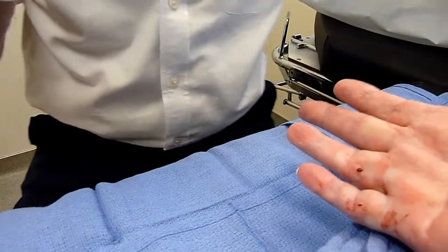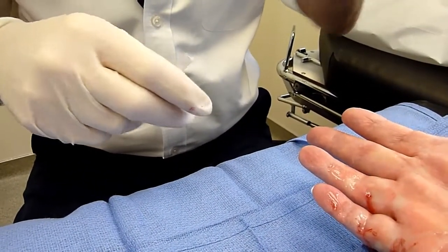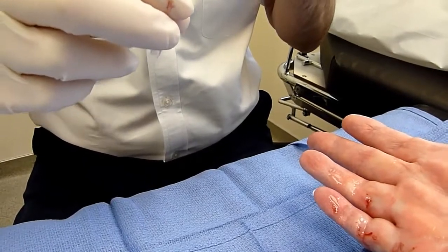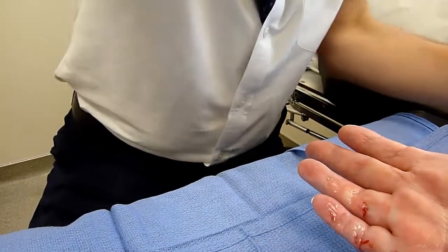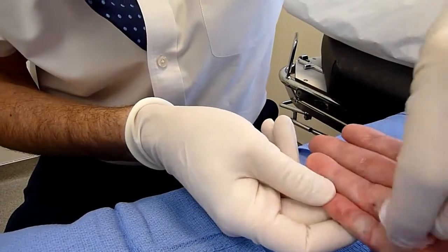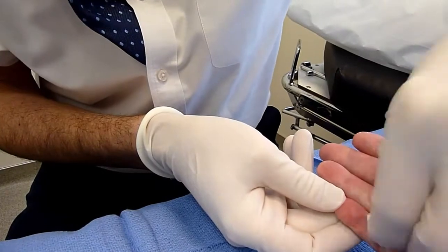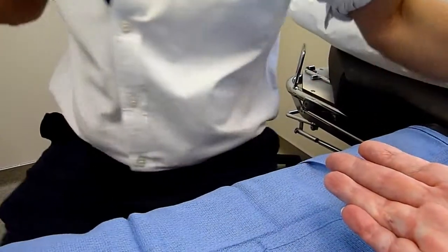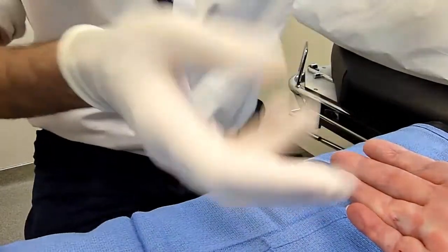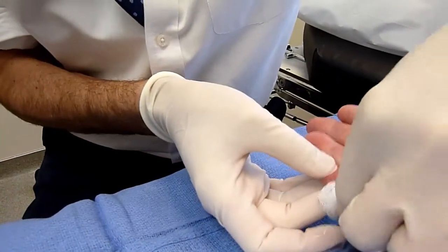And then I'm just going to be washing you up a little bit. Any chance that we can just do a simple dressing? Well, it's Band-Aids like Charlie does. Band-Aids is good. Yeah, Band-Aids. I like Band-Aids. Yeah, and if you're oozing a little bit beyond the Band-Aids, I put a little light roll, but it truly is just Band-Aid. Yeah, perfect. And hold on. I'm happy if you are. Yeah, no, this is perfect. Yeah, this is how they go.